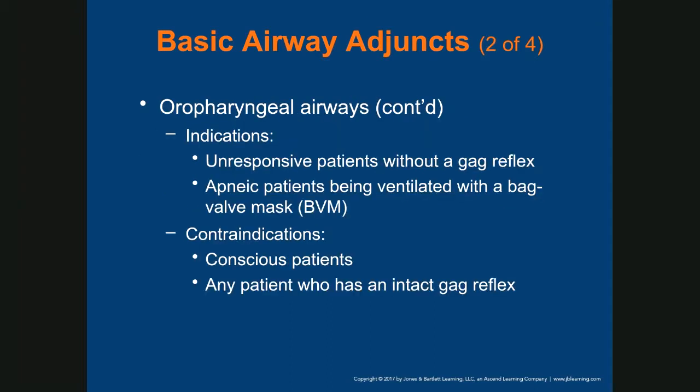So unresponsive patients without gag reflex and a ventilation issue, and apneic patients being ventilated with a bag valve mask, BVM. Contraindication: if the patient is conscious, do not use the OPA. If the patient has an intact gag reflex, they will gag on the airway, so you cannot use it in that patient.